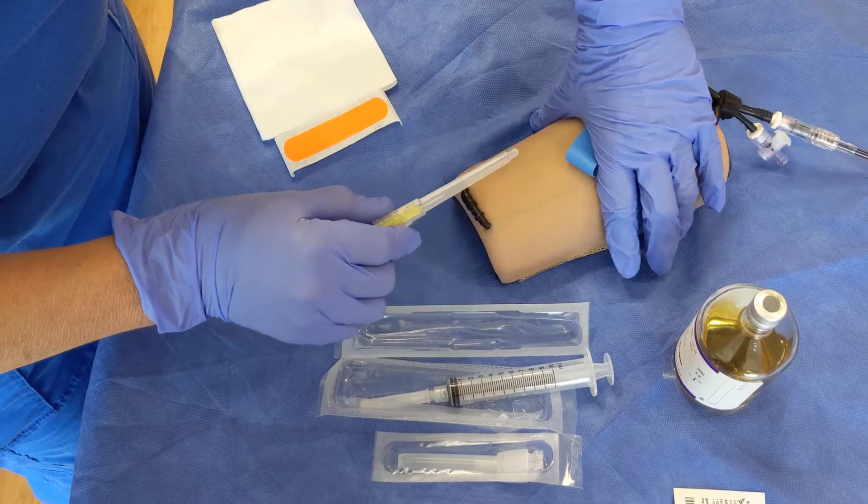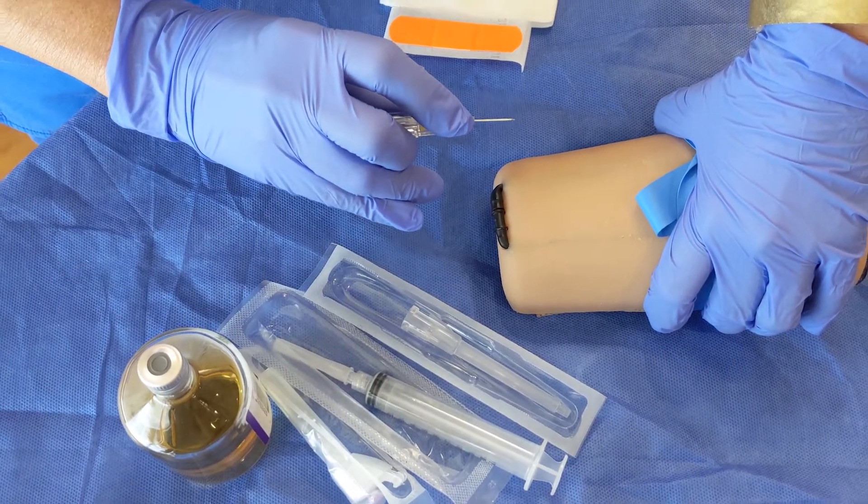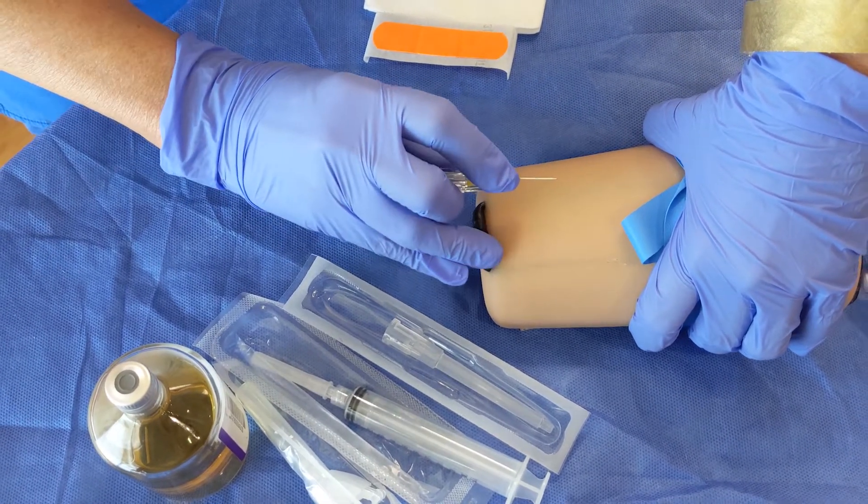So let me demonstrate. Since we're doing a blood culture, we would prepare our skin per our institution's policy. So here we go.